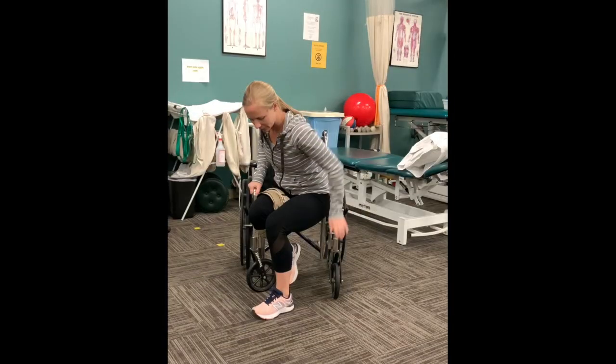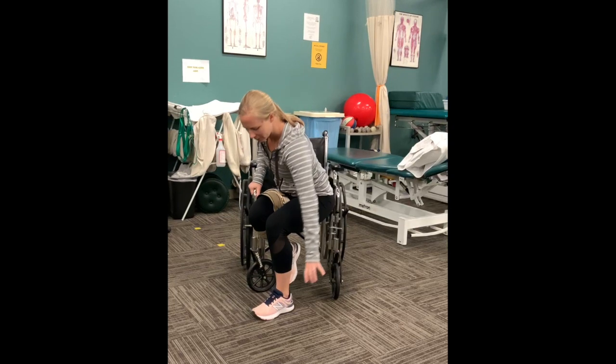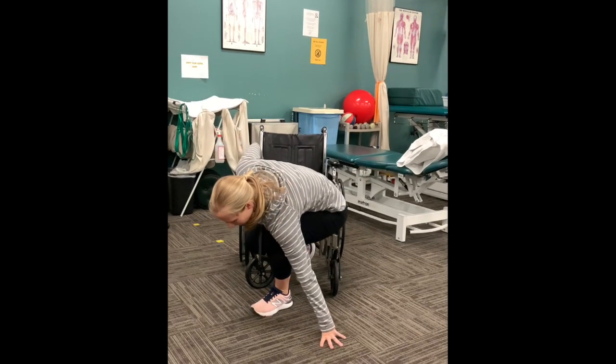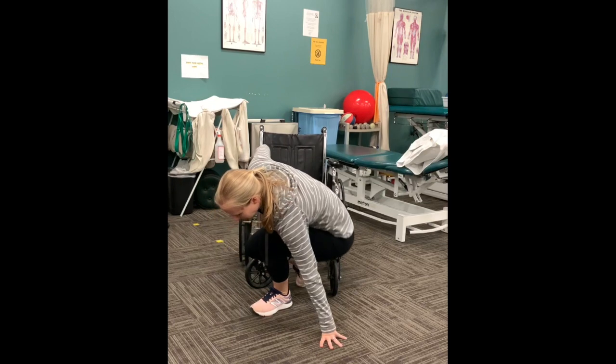The patient will now flex their trunk forward and shift their body weight onto their sound limb. They will then reach for the floor with the leading hand. It is important to note that the patient must have a fully extended upper extremity while reaching for the floor to ensure proper stability during the transfer. Lastly, the patient will slowly lower themselves onto the floor using eccentric strength in the sound limb and upper extremity to control their descent.